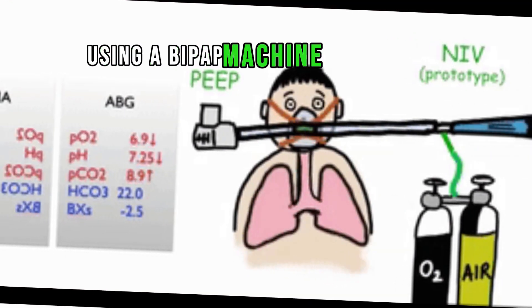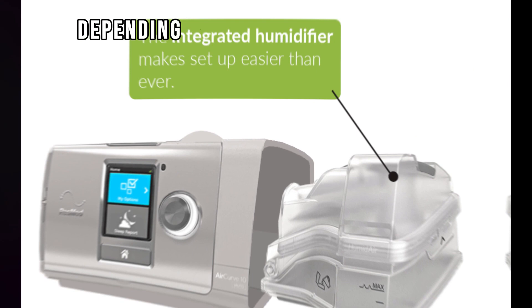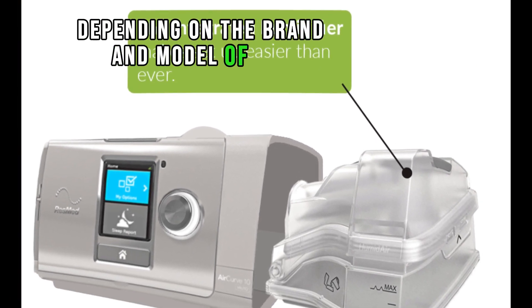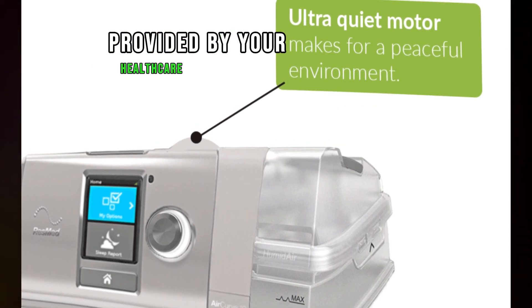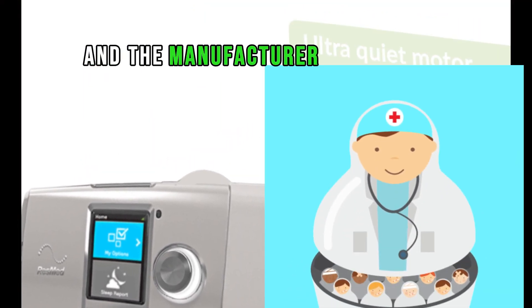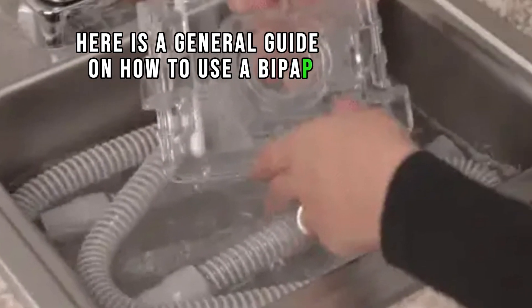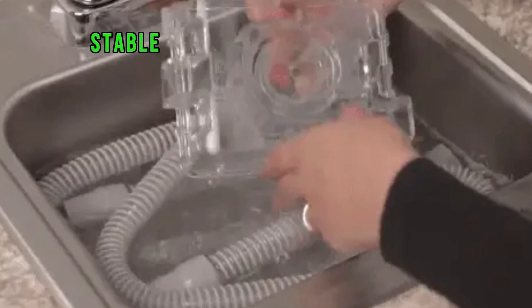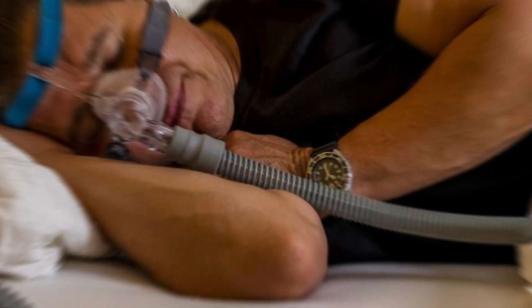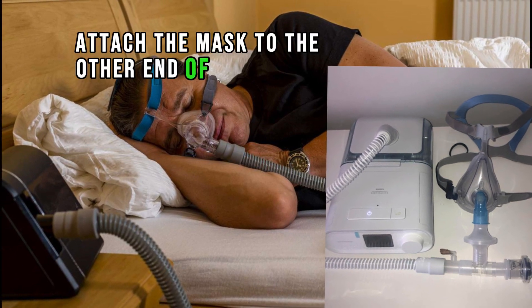Using a BiPAP machine involves several steps. It's important to note that specific instructions can vary depending on the brand and model. Always follow the guidelines provided by your healthcare provider and the manufacturer. Here is a general guide: first, setup — place the BiPAP machine on a flat, stable surface near your bed. Connect the tubing to the machine, then attach the mask to the other end of the tubing.